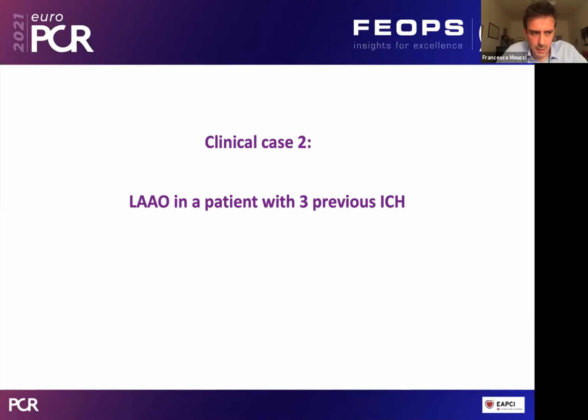Thank you. This is, again, a very good question. It comes from an experienced operator. I don't know the name, but for sure, the question is a very good one. And my answer is that for sure, measures can change in the cath lab from what you measure on the CT scan, let's say 2-3 days or 15 days before, because of the loading condition on the pressure of the left atrial side. So you have to measure in the cath lab with a reasonable left atrial pressure, let's say above 5 or 10 millimeters is better.